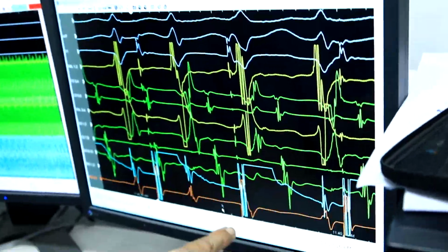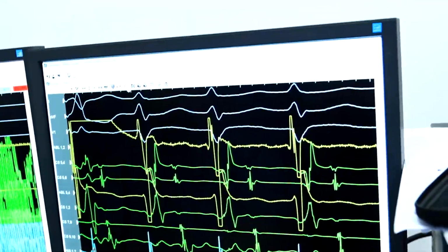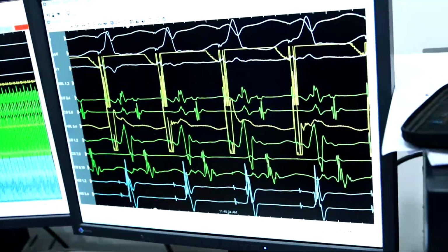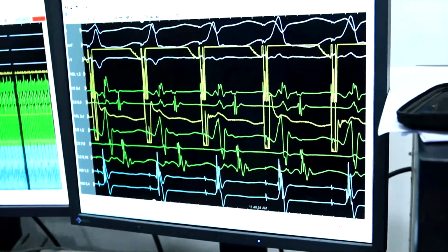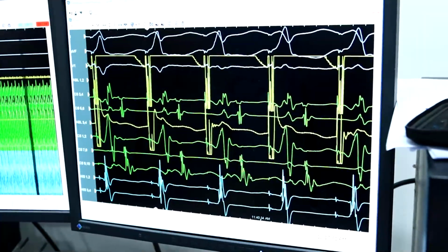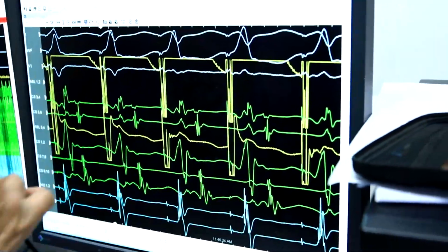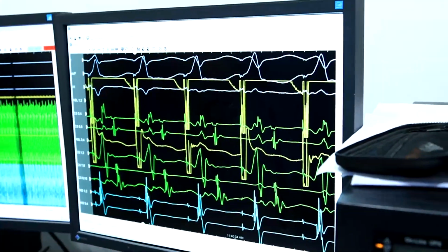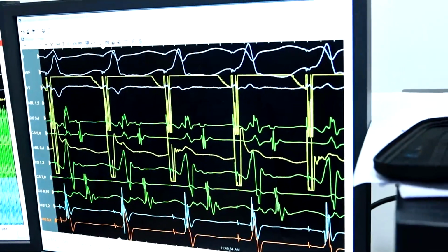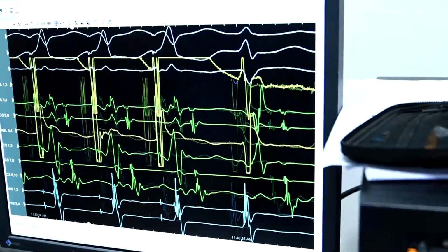This is pacing from this side. I did pacing also here. This is pacing from the ablation catheter in the left ventricle, prior to pacing from LV from the quadripolar catheter. You can see a very short VA time, which is totally different from pacing from the RV. So we decided to advance the CS high up in order to map all this annulus. And we succeeded.